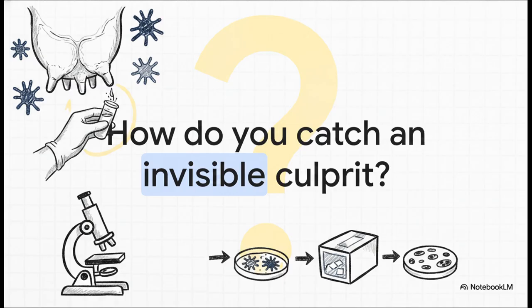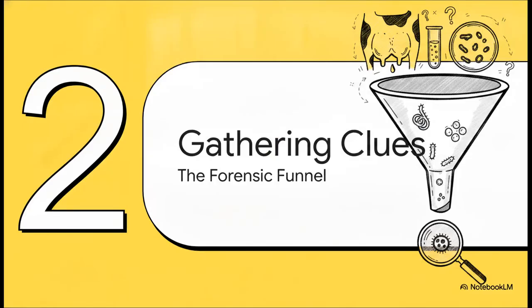Well, the absolutely critical first step happens right there in the milking parlor, collecting an aseptic milk sample. Because let's face it, a dairy farm is literally teeming with background bacteria. If we aren't super careful collecting that milk, we risk contaminating our primary evidence with random environmental organisms. Plus, the target pathogens we're actually looking for are surprisingly delicate, so that sample needs really prompt, safe transport straight to the lab.